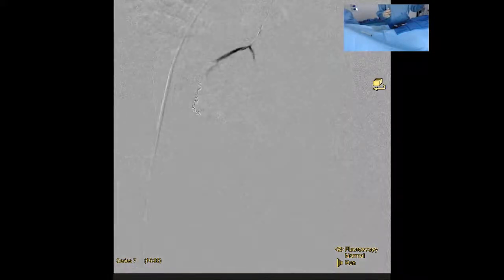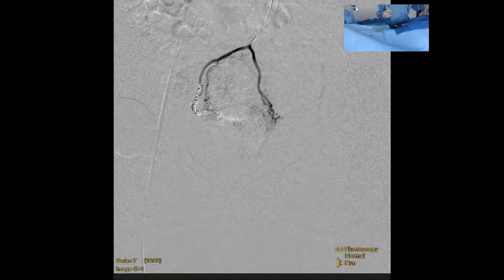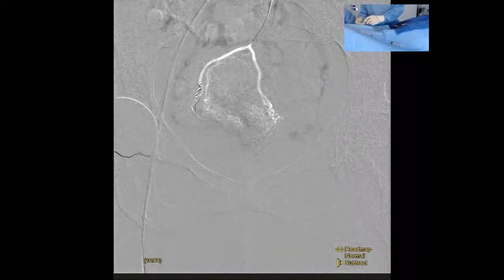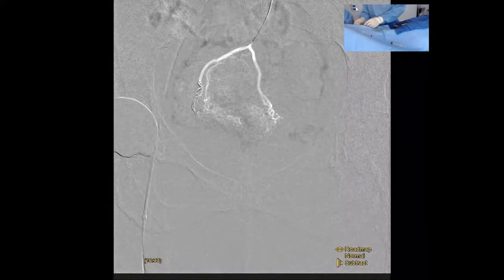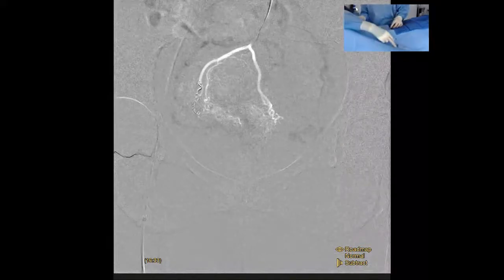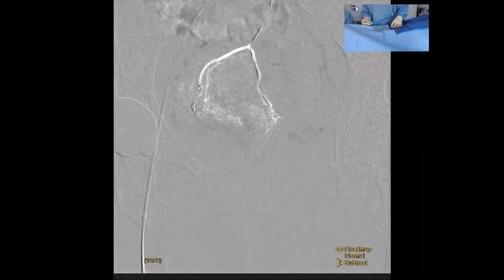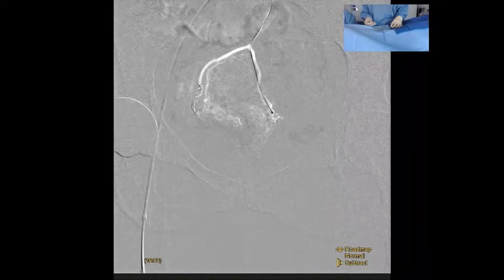Yeah, so it's a really good question. At this point, I probably will not take a look at that anastomosis. In order for us to really go treat a middle rectal in the same session of treating from the superior rectal, we'd have to see it as a really prominent inflow vessel. And we'd want to see it really perfuse an area of the hemorrhoidal cushion that we couldn't get to from here with our beads, because meaningfully, these patients will get a significant benefit, and we like to see some change in symptoms, like a failure of therapy, before we go back.